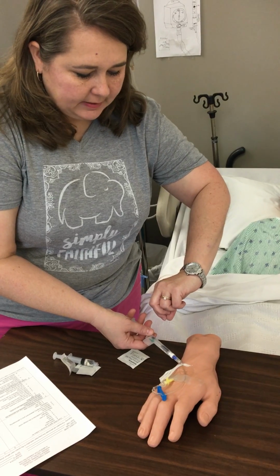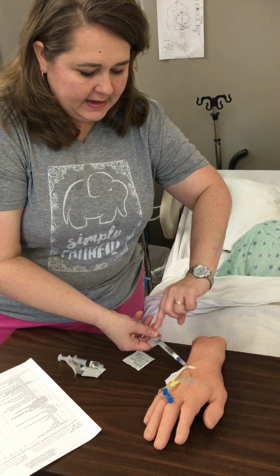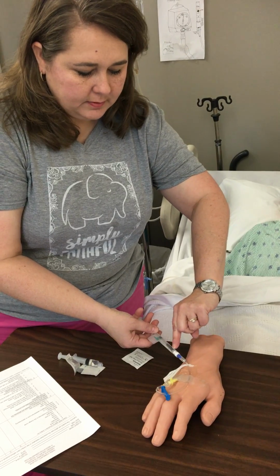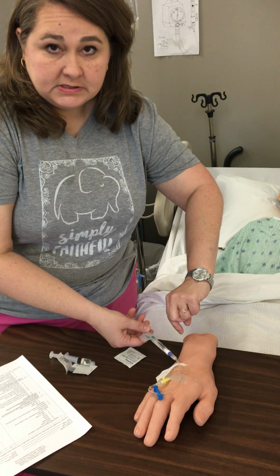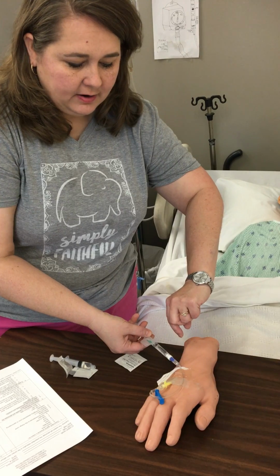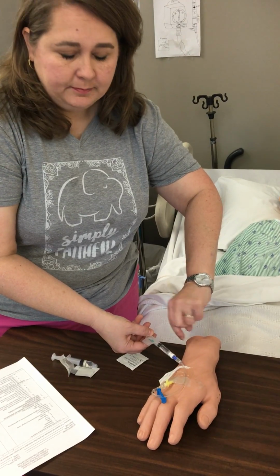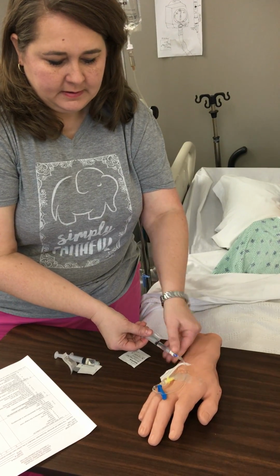I have my watch, and I'm going to push at that same rate, observing my plunger with the measurements on my syringe. And for purposes of video, I'm going to time-lapse this and say that our rate of administration, our medication, is complete at the end of our time.